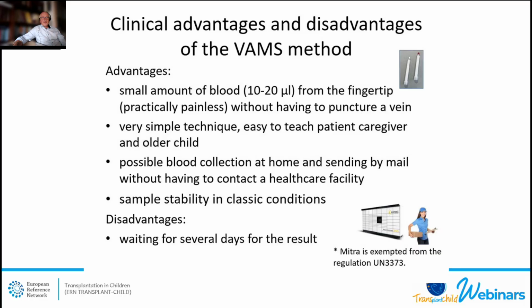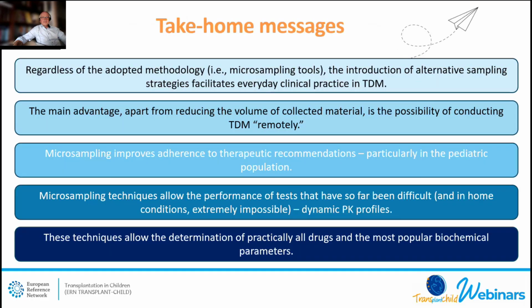And I think I will ask Arek to give a summary of our speeches. So we prepared some take-home messages, regardless of the adopted methodology. Microsampling tools, the introduction of alternative sampling strategies, facilitate the daily practice of TDM.